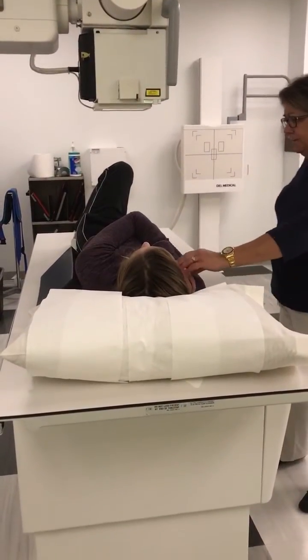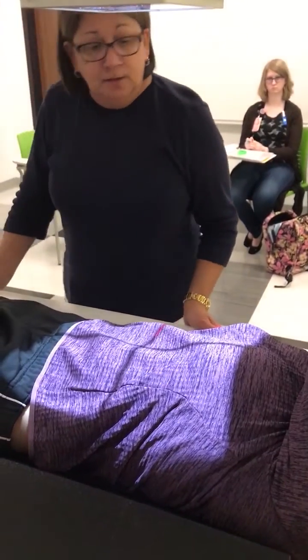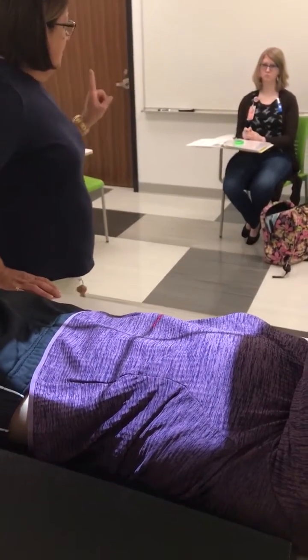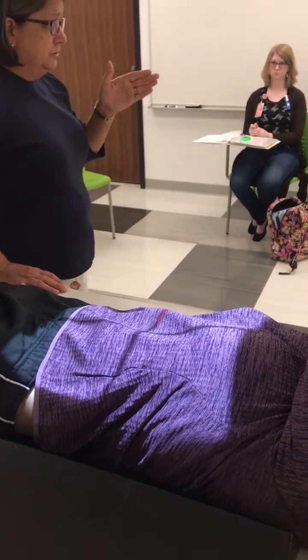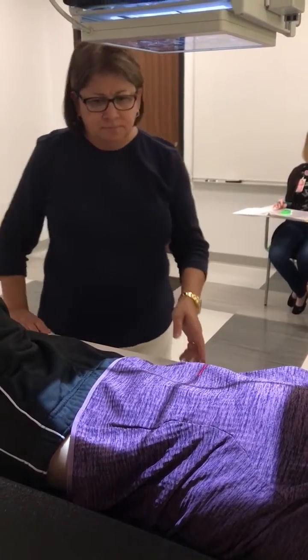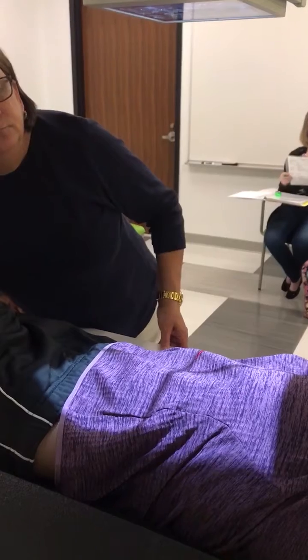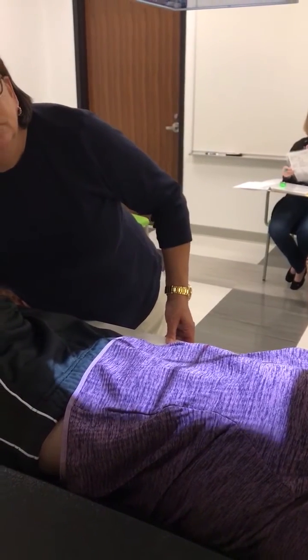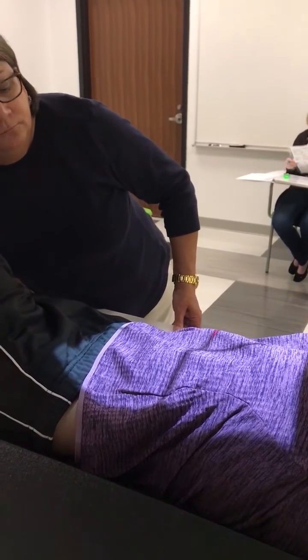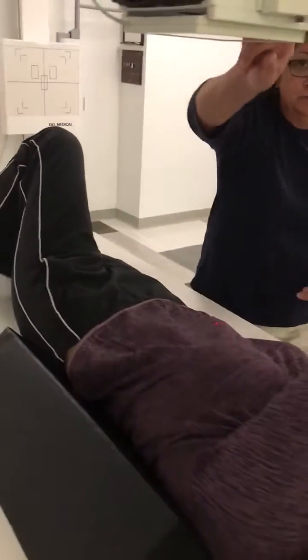Bring that left arm up. Put your right arm down to your side. Your instructions say to center to the vertebral column. And when we get done, I'll explain to you what that means.